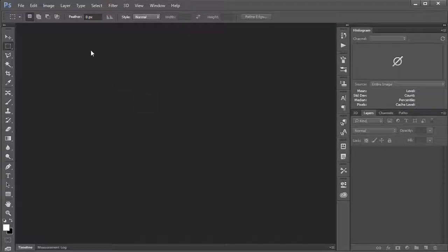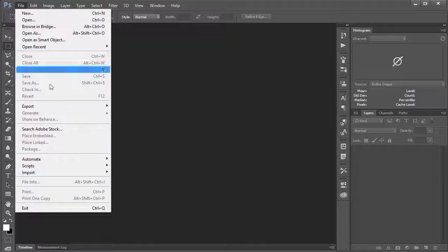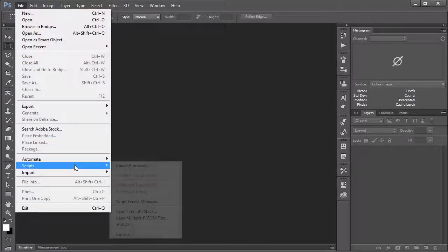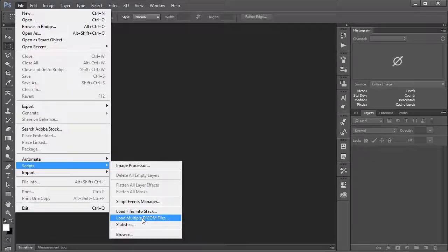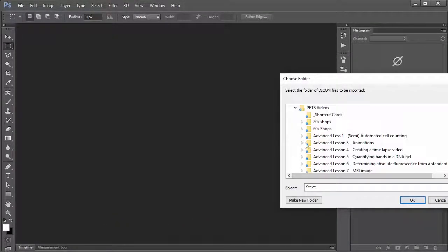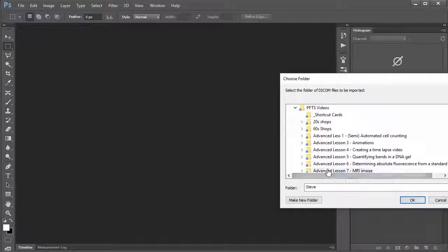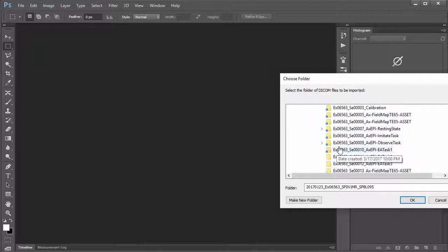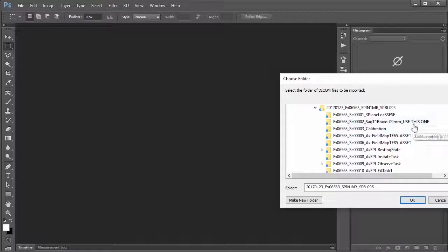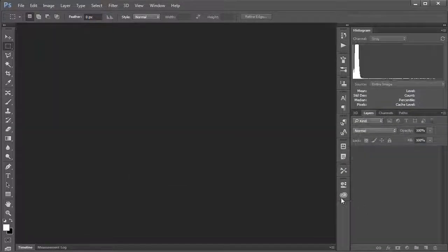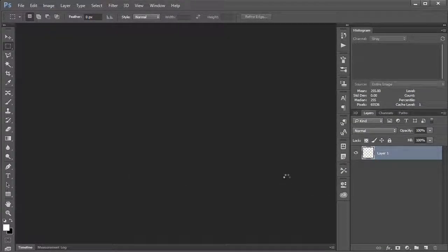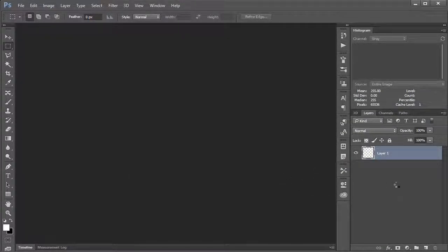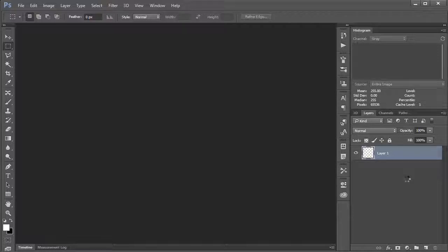First off we need to go up to File and we want to say Scripts and we want to say Load Multiple DICOM Files. I'm gonna navigate to my folder with my DICOM files. I'm gonna use this one that says 'use this one'—yours will probably be named something different. Then I'm gonna say OK and Photoshop is gonna import all of these individual files, I think there's about 200 of them, into a stack in my layers panel here.